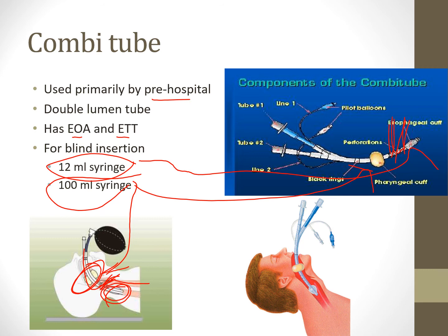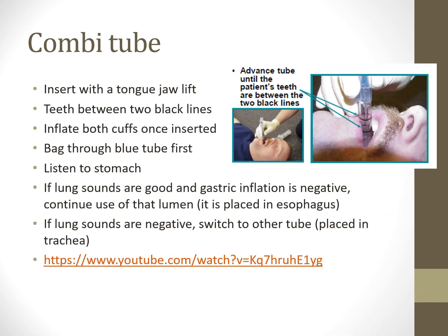So if we ventilate and there's no chest rise, you're going to switch over to the other one. This one's not used as much anymore, and then there is, I believe, a YouTube link that you'll have to watch in the regular presentation on this. And I think this is the link here that you're looking at.